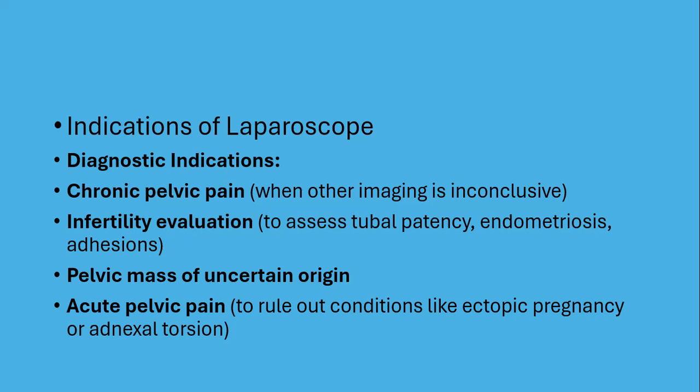Indications of laparoscopy. Diagnostic indications. Chronic pelvic pain, when other imaging is inconclusive. Infertility evaluation, to assess tubal patency, endometriosis, adhesions. Pelvic mass of uncertain origin. Acute pelvic pain, to rule out conditions like ectopic pregnancy or adnexal torsion.